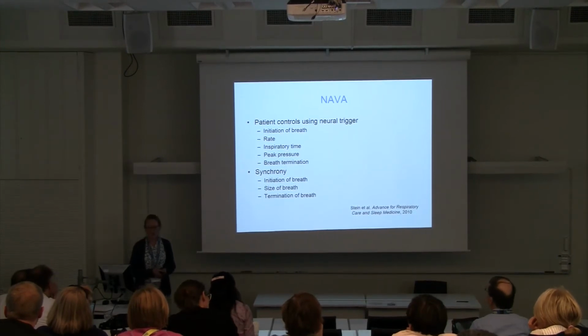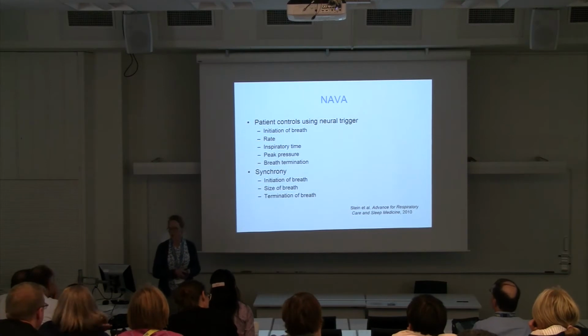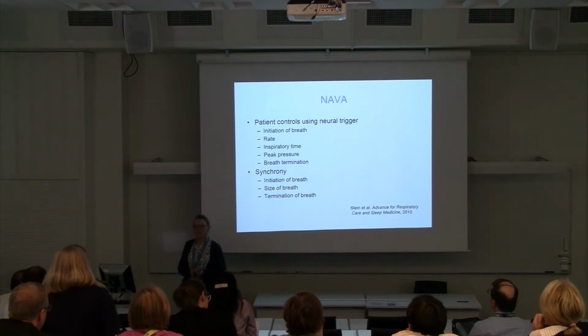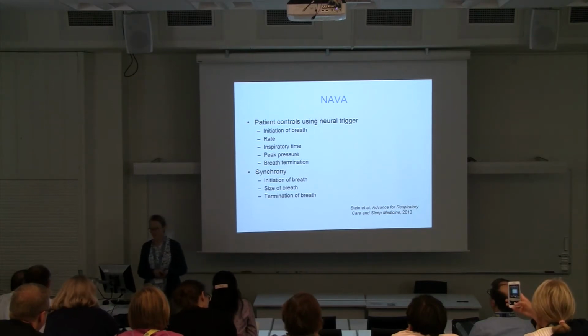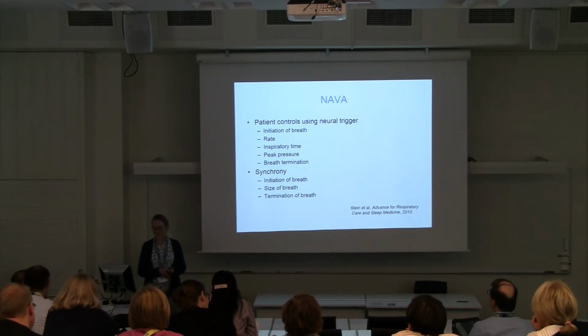In NAVA ventilation, it is the patient that controls the initiation of breath, the respiratory rate, inspiratory time, peak pressure, and breath termination. And this occurs in synchrony with initiation of breath, size of the breath, and termination of breath.